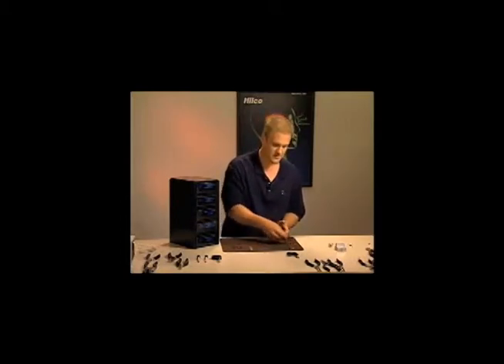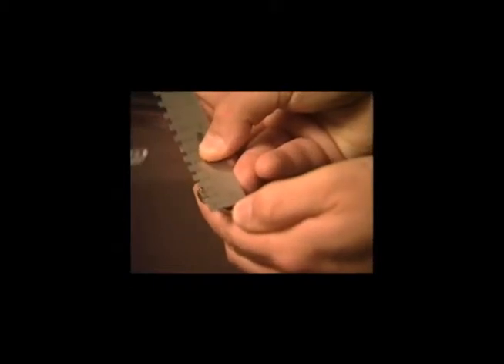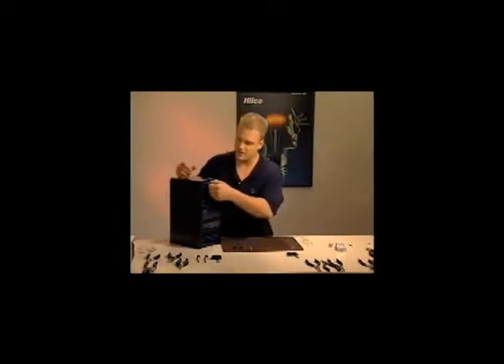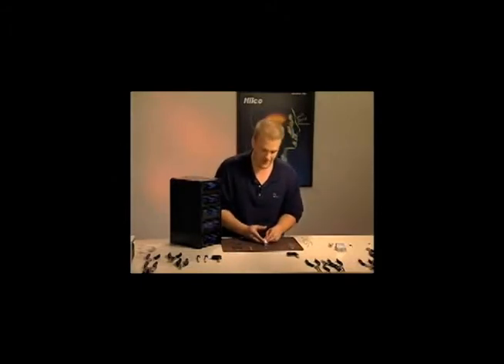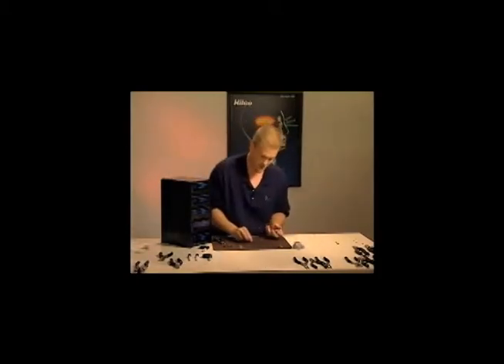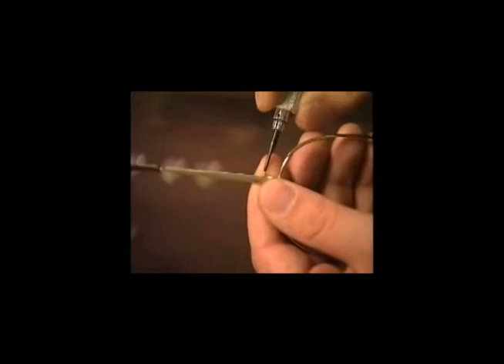To find the length of the screw, you take the ruler that has notches in it and has a corresponding number for the length of the screw. It's going to be a 3.5. So I need a 1.4 by a 3.5, and then you can go into your inventory. All of HILCO screws are labeled by diameter and then length. So I have my 1.4 by a 3.5. Spill out one of the screws, and then we can insert that into the frame.